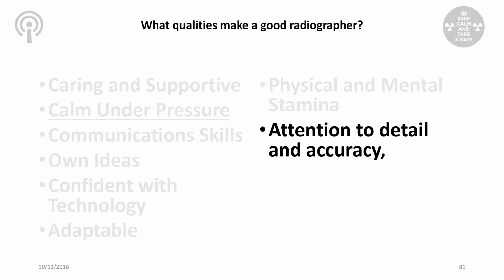Because you need to think about how the clinical history of an x-ray request relates to the image that you've acquired, and whether you can say, okay, that image is of diagnostic quality, I don't need to do another one, or actually, I've missed a bit of anatomy off, that's important, I do need to do another image. And if so, what image are you going to do, and what are you looking for?